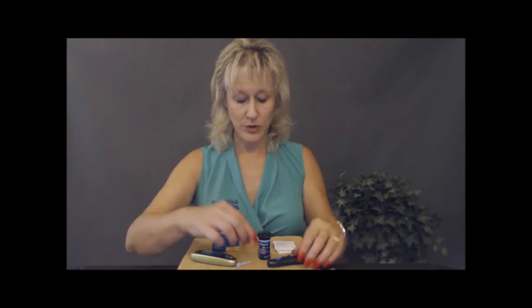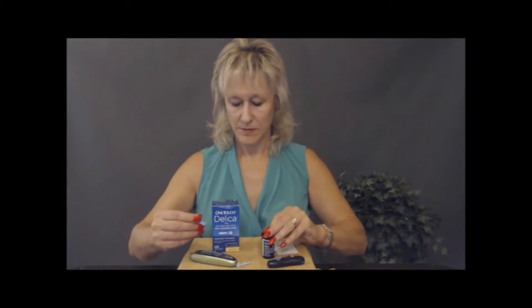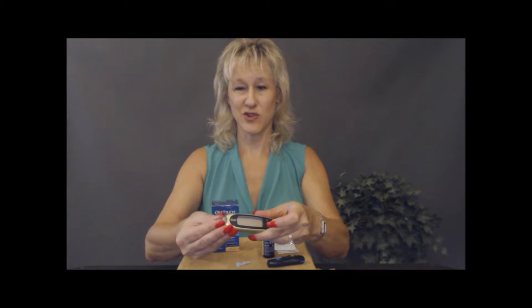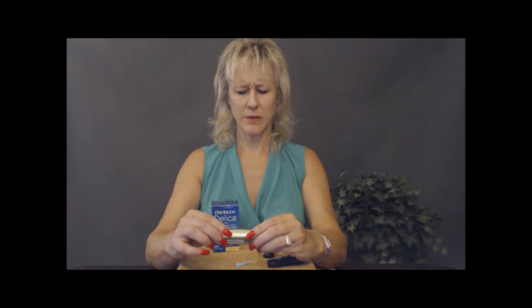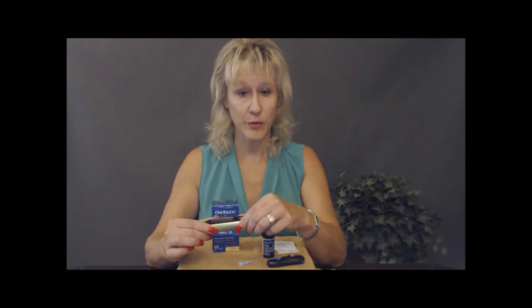Now the needle is all set. Let's go ahead and grab the glucose strip. You're going to pop that in — it's very hard to not over-touch these, so just push it in gently until it stops. You'll see something that shows either a drop of blood pictured on it or some other indicator. Just check your instructions with the manufacturer for the one you have.